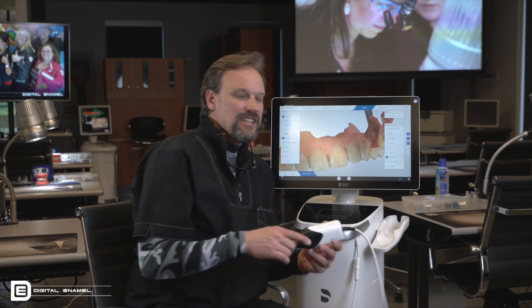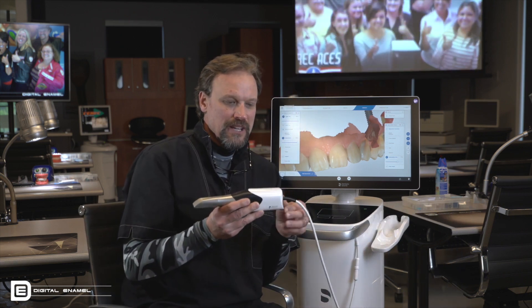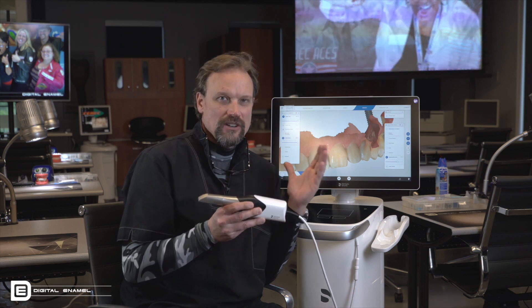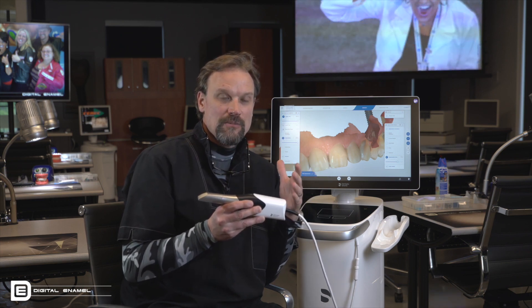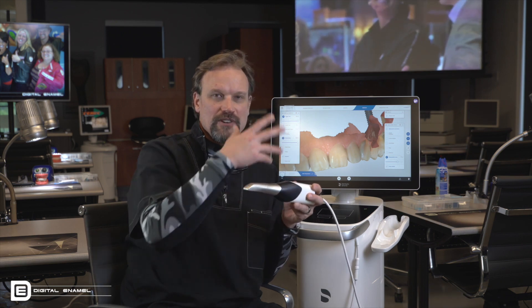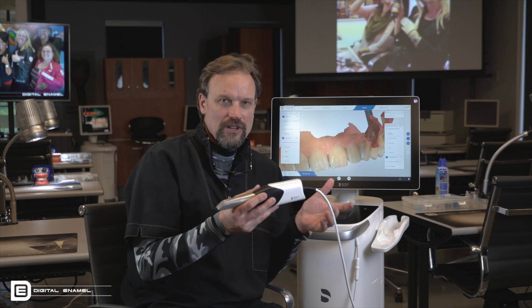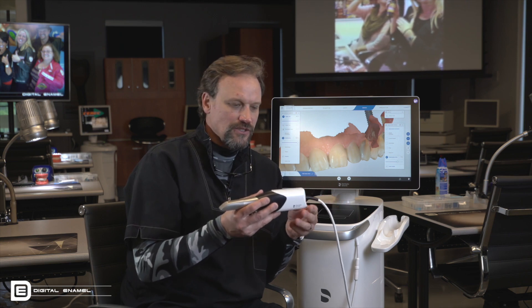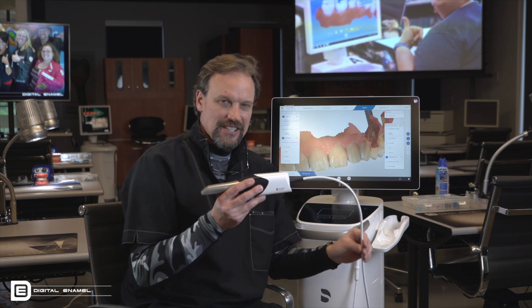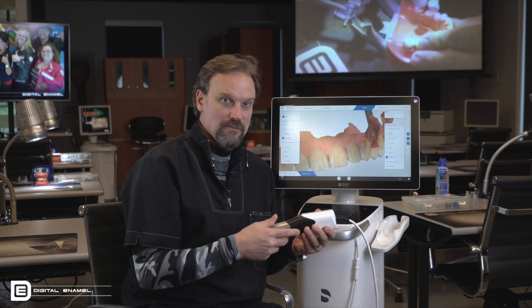Cameras that have tons of data going through them — when you have it as wireless, you're limited by the wireless capabilities of the computer and the camera, not to mention interference from the wireless signals throughout the air. We all know this from our phones. So when you have this amount of data flying through, you've got to still have it as corded. It's a major advantage.